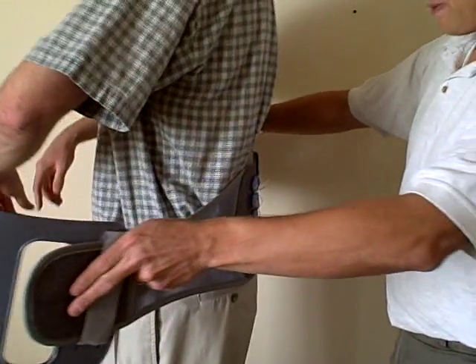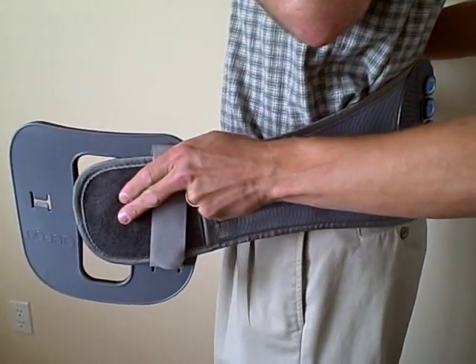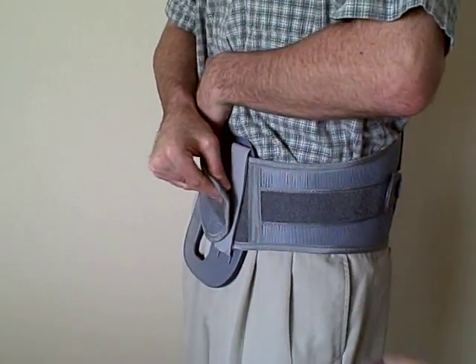To put it on the patient, we simply place the back brace around the patient with the back panel centered on the low back, then wrap it around with the right side of the Velcro going over the left.